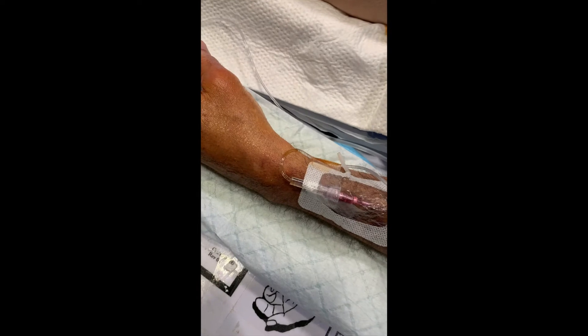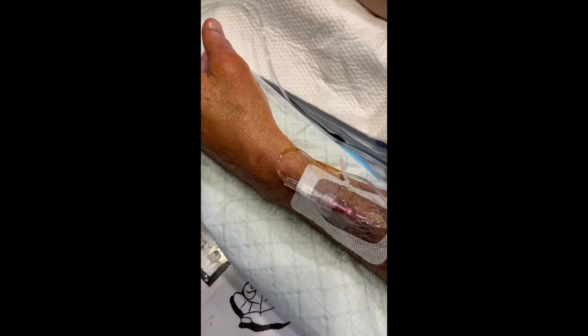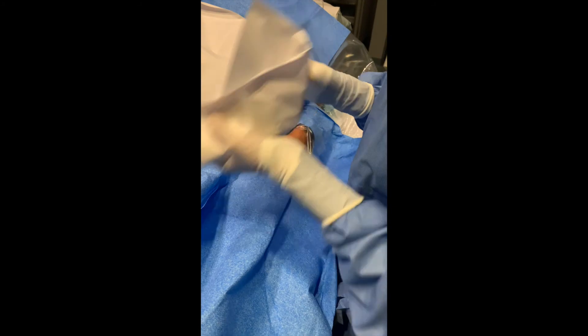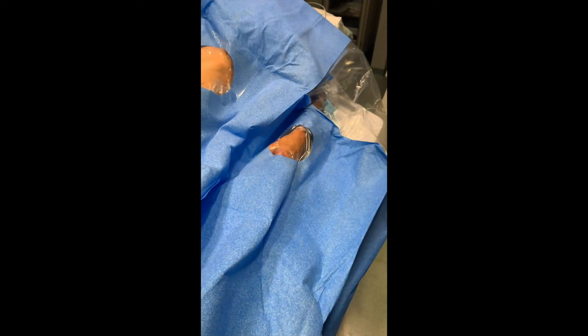I find that asking the patient to tuck their thumb under is rarely necessary. Here we have draped the area and are ready to go.